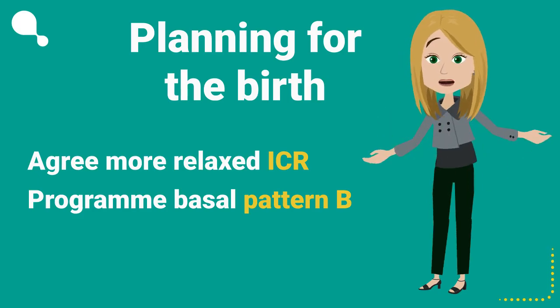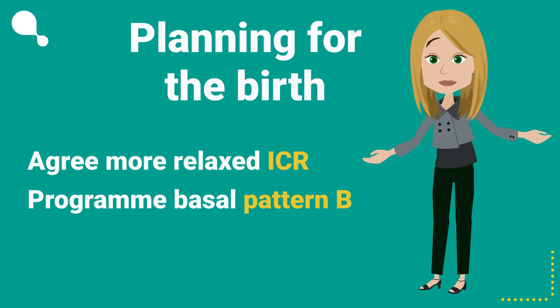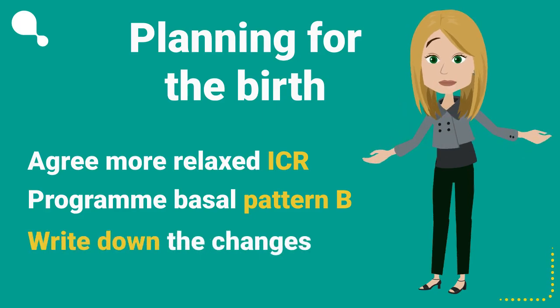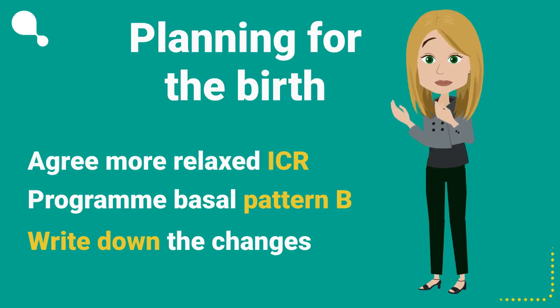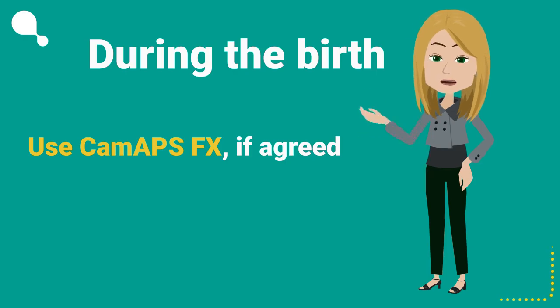Pattern A's basal rate would have been increased throughout the pregnancy as a safety net in case CamAPS FX couldn't work. Only swap to pattern B on the pump when the baby is born. All these changes should be written down in your medical notes, and you should also have a copy. During the birth, CamAPS FX can continue to manage insulin delivery, if agreed with your healthcare team.